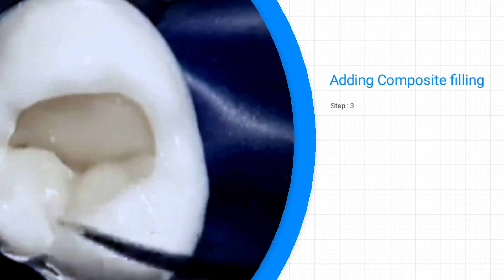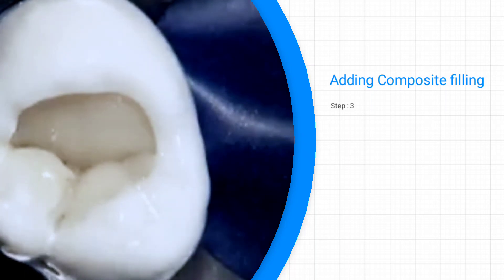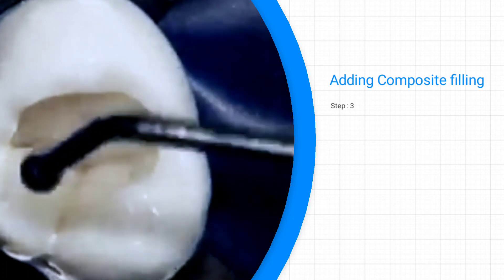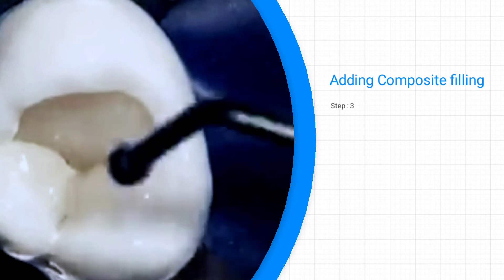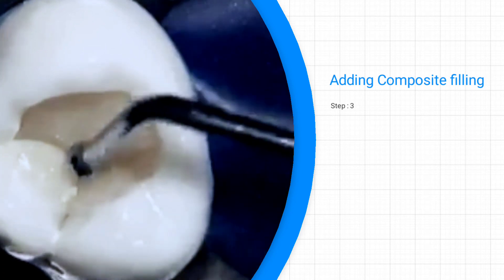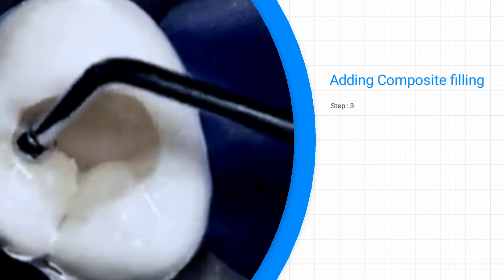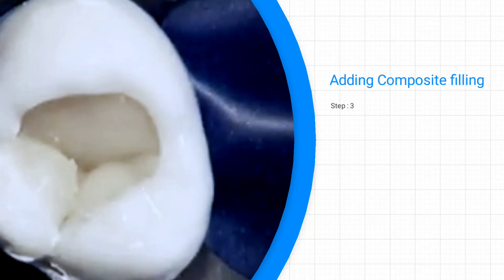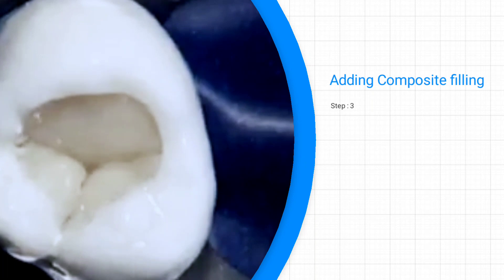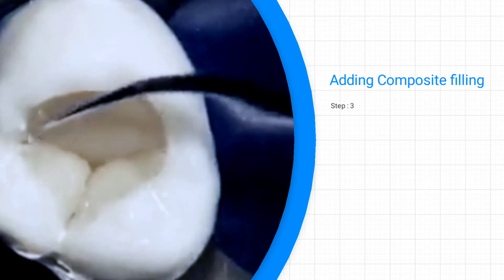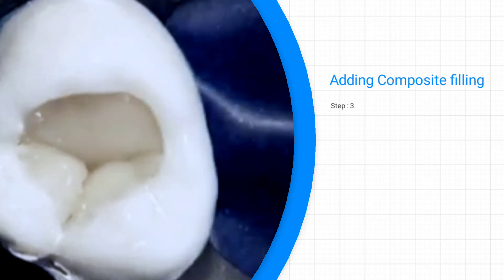Restore the tooth by bonding the composite filling on the enamel and reshape the tooth as it was earlier. Depending on the size of restoration being constructed and due to the requirement of placing composite in layers, building up your restoration to its needed shape may take a fair amount of time.